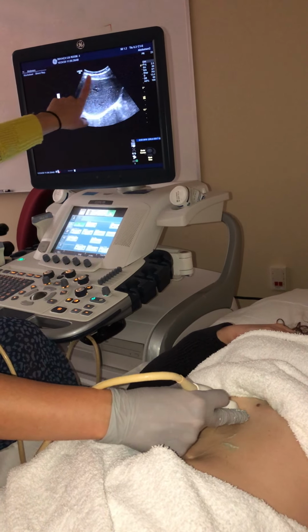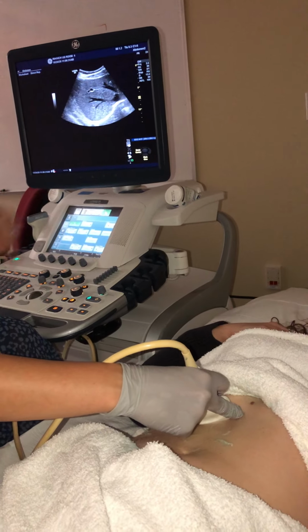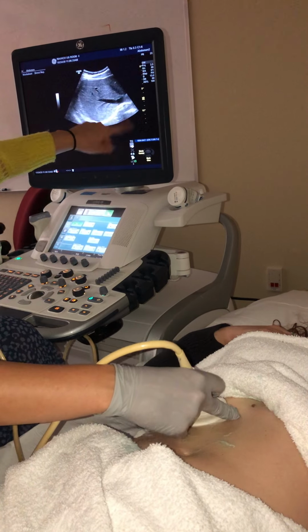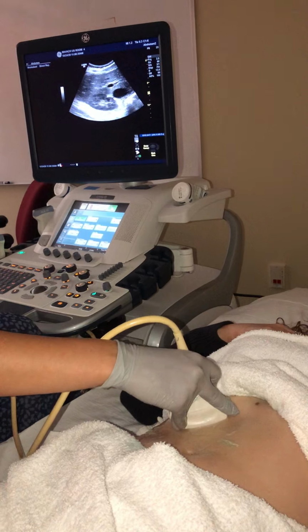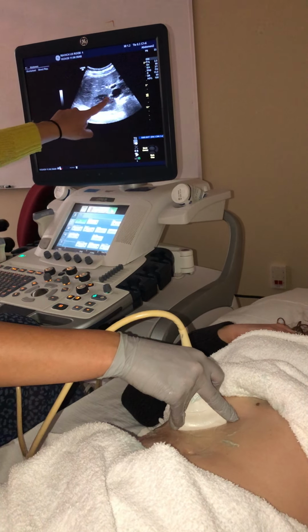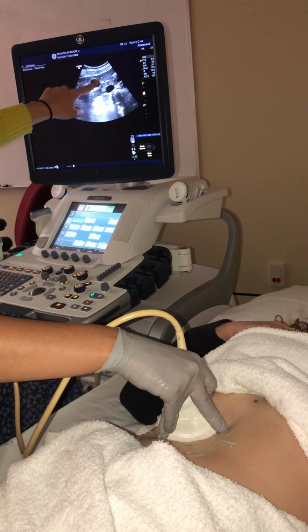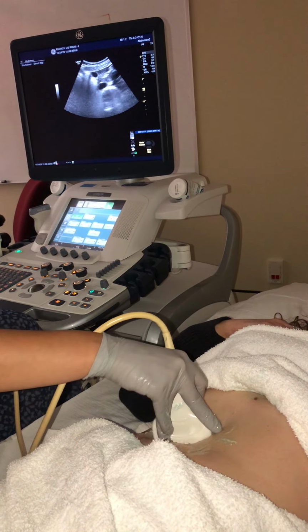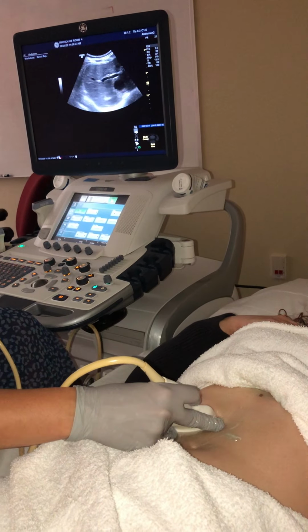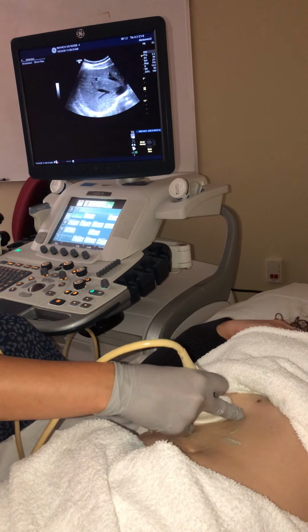Now we have a little bit more of a rectangular shape here instead of a triangular shape, how we saw it in Sag. Our hepatics appear to be coming in on the other side. That's just because of how our transducer is positioned. And now we're getting a nice C shape of the kidney, and we're getting a circular shape of the gallbladder, as we would expect in a transverse position. Just sweeping through that.